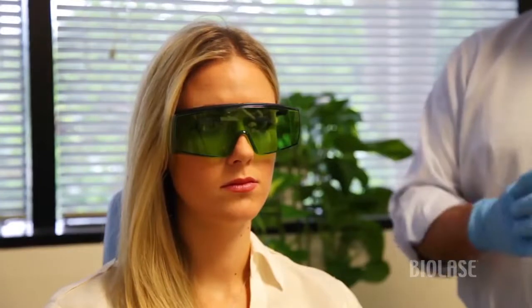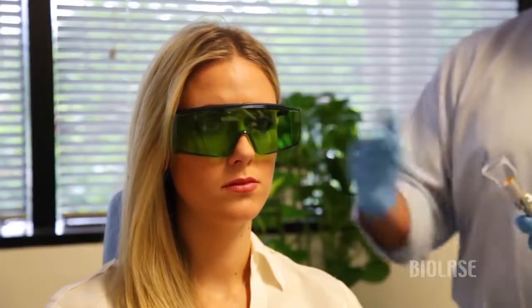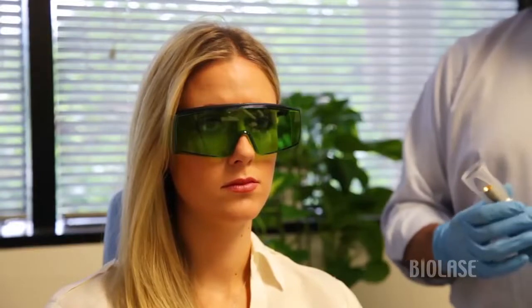Typically with light therapy there's either high power or low power. Low-level laser is more popular for wound healing, going all the way down to the cellular level to assist with cell propagation. In this case, however, we're using high-powered laser because high power is associated with an analgesic effect.